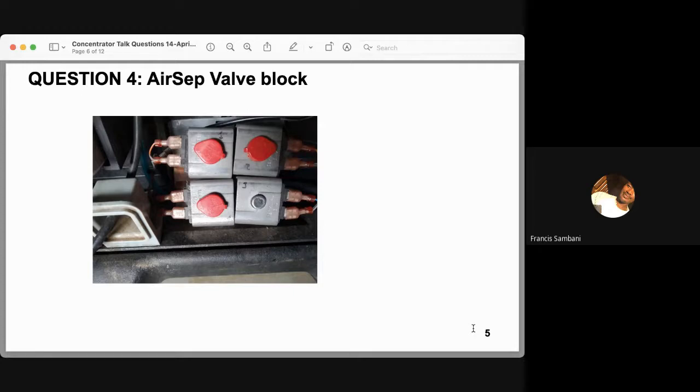When the coil becomes energized or magnetized, the paper clip or tip of the screwdriver will be pulled down onto the valve stem, indicating that the valve coil is operating. If the coil is faulty, it will not be energized, and that will require replacement. Those are the two ways you can check if a solenoid valve is working or not.